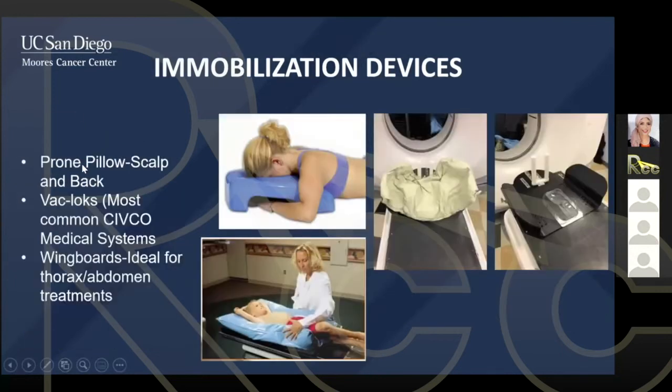We also have prone pillows, which is this cushion right here. This is mainly for scalp and back treatments so that the patient is still in a comfortable position and we can get to their scalp or their back.